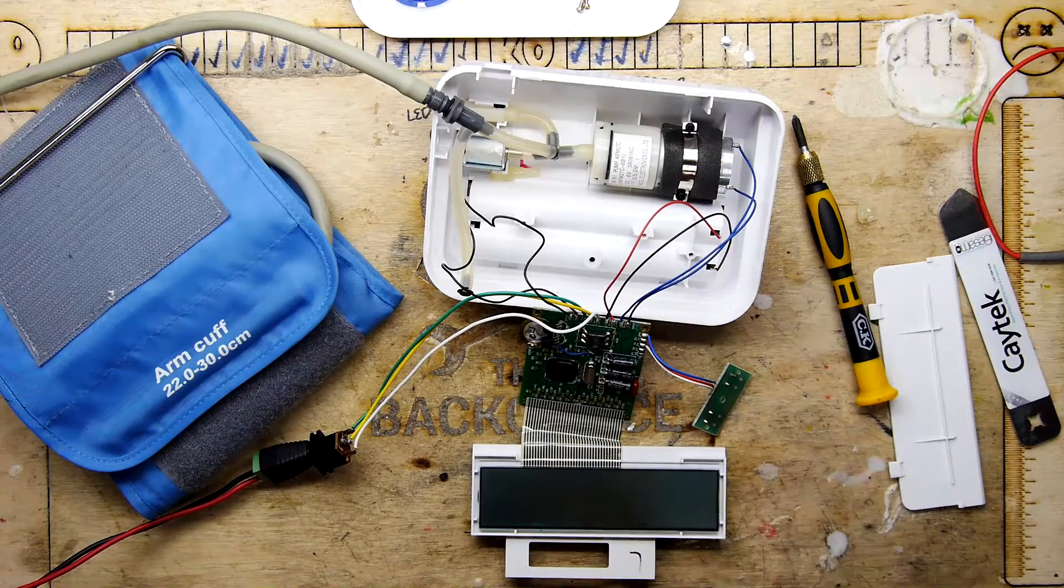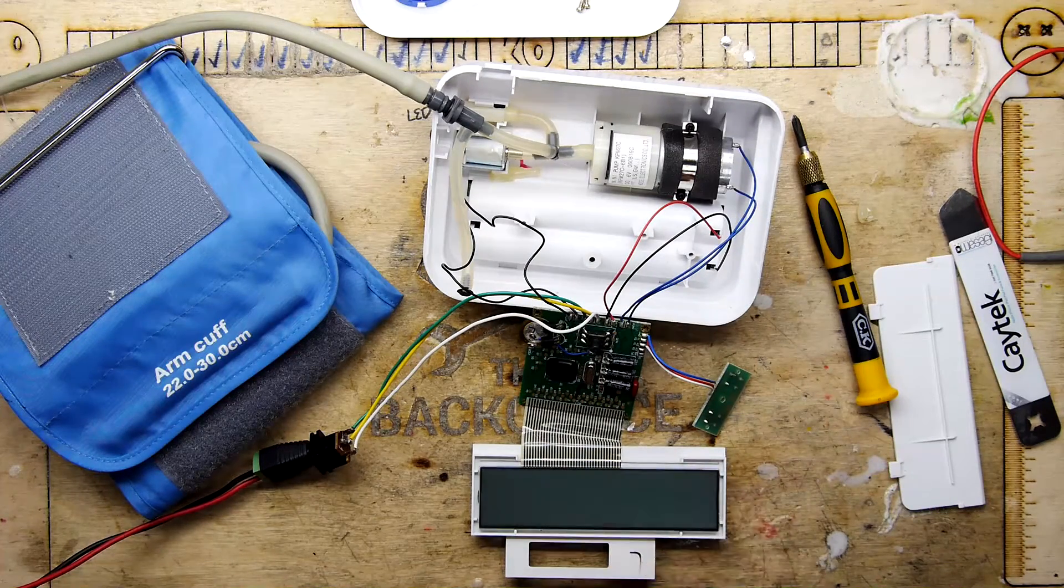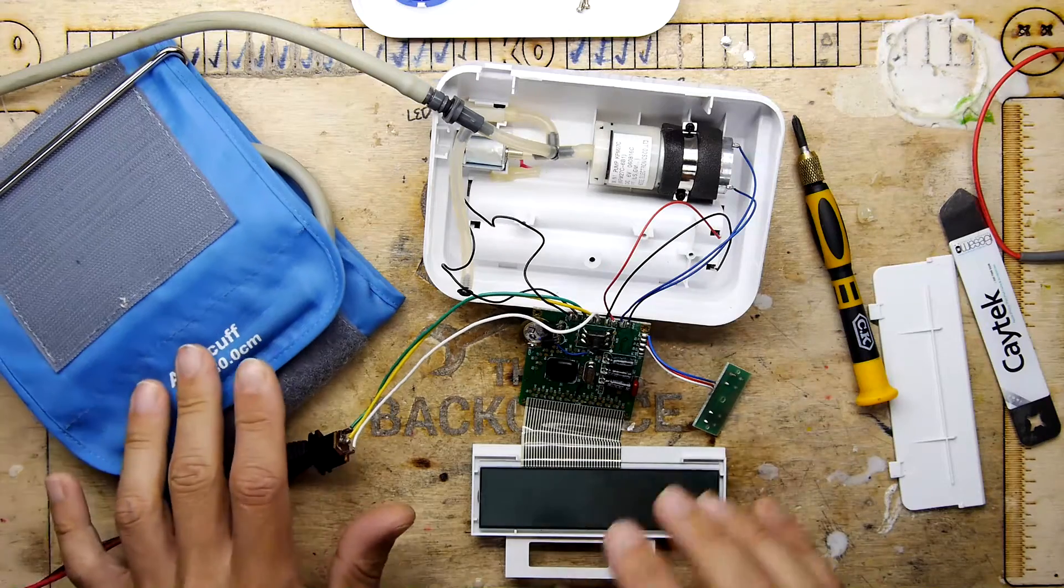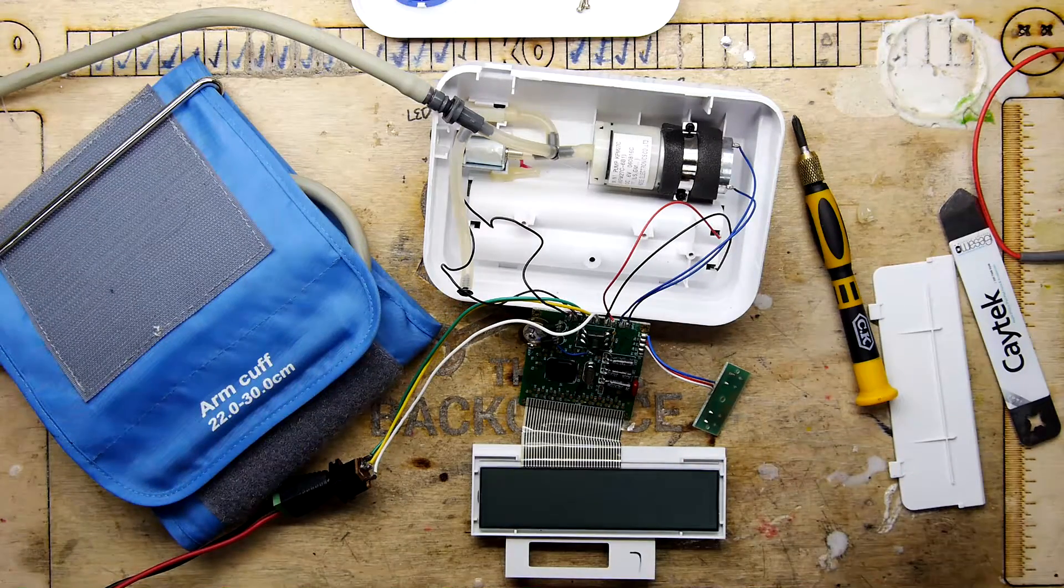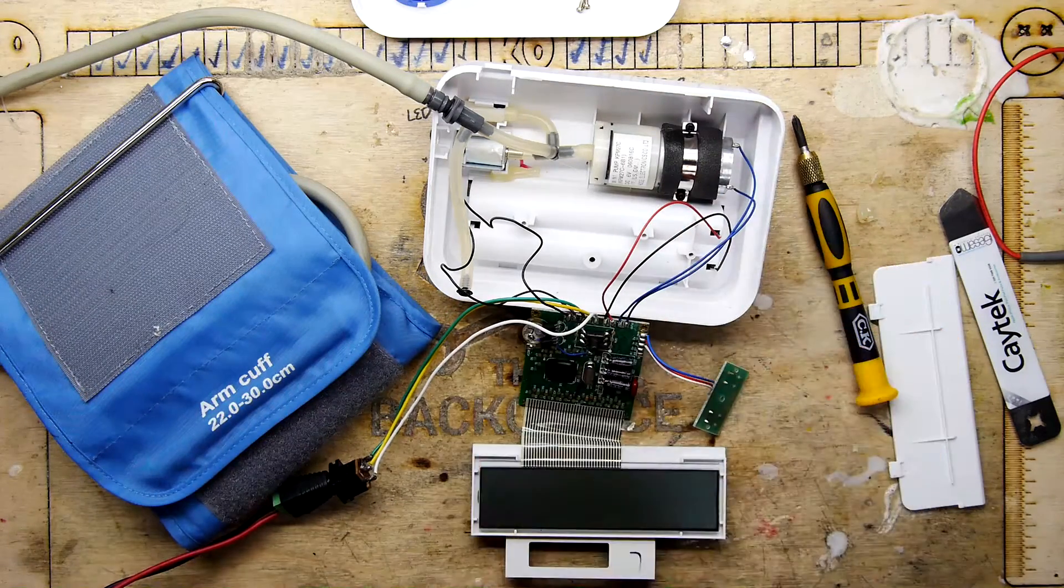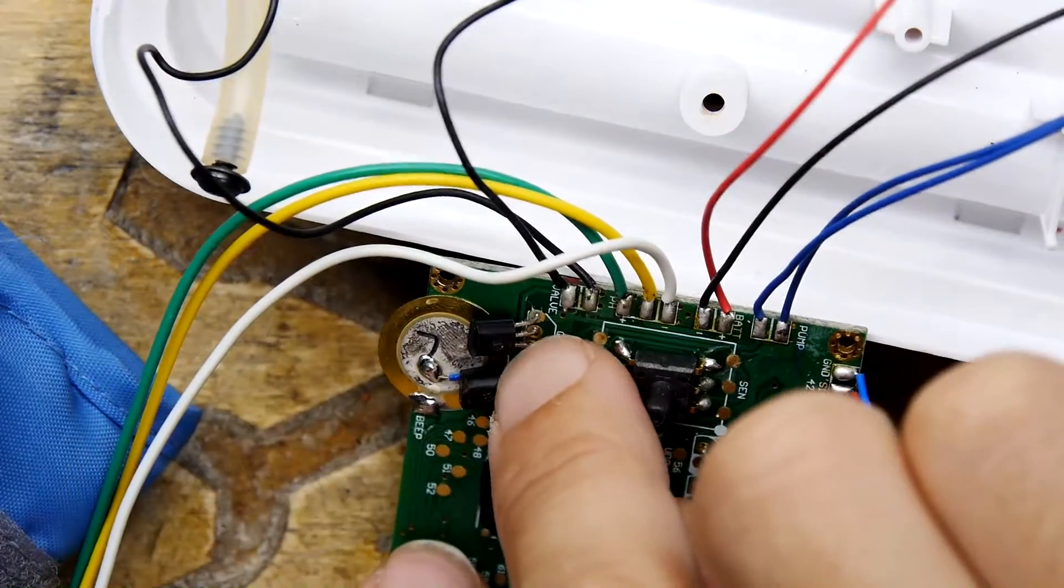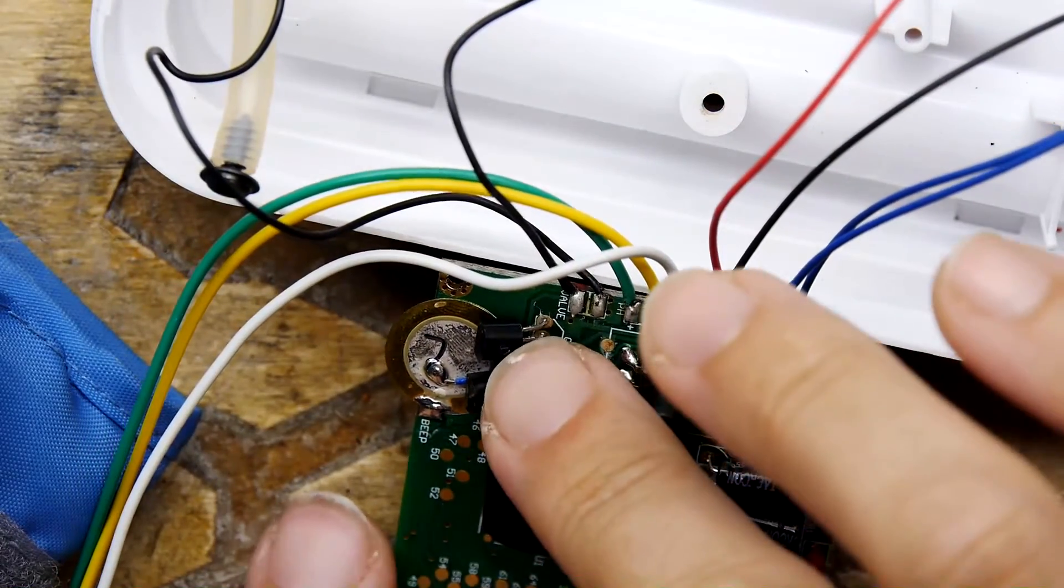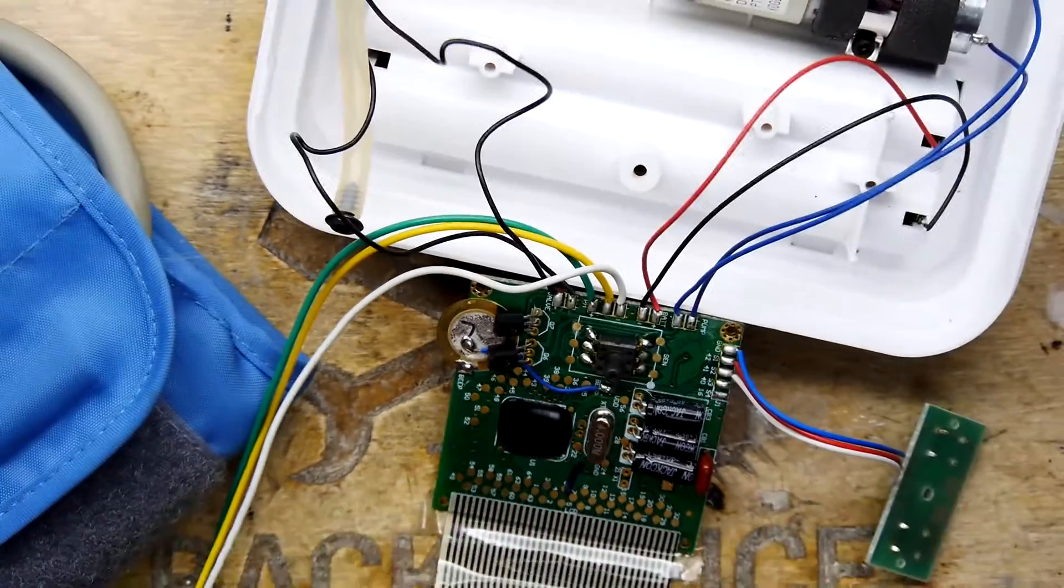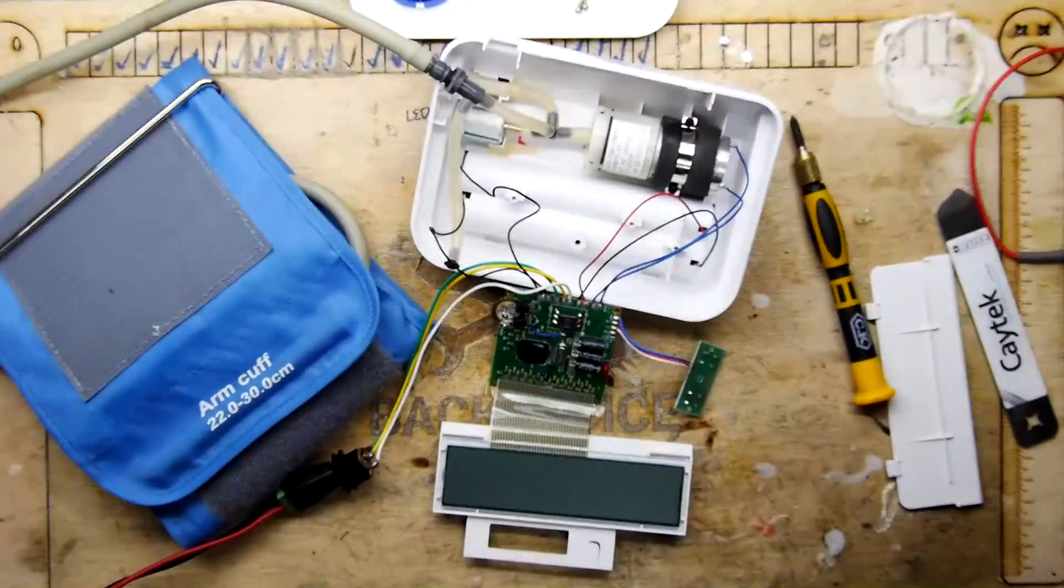However, that being said, I did do a tiny bit more investigating. Because of course, there is power going to the appropriate parts, which means you can play with it. So if you look here, you've got the, oh, there we go. You've got your transistors here. One of them controls the solenoid and one of them controls the motor. And you can see I've blocked off the port here.